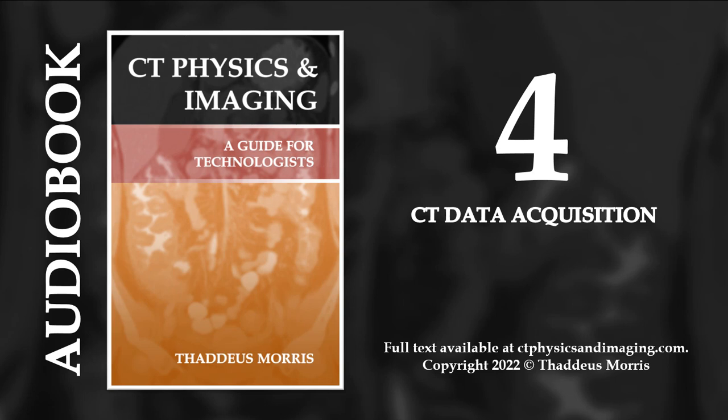Case study: new protocol design. A radiologist asks you to design a new high-speed CT chest protocol to be used on infants and other patients who cannot control their breathing. What acquisition thickness would you suggest for your 32-slice Toshiba scanner? Assume it uses a uniform detector array with 0.5 millimeter detector elements.